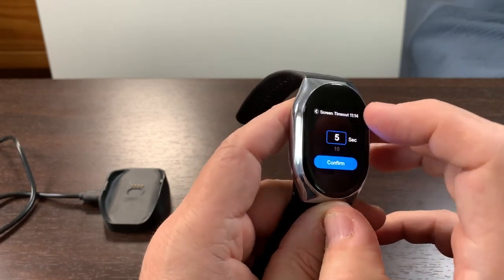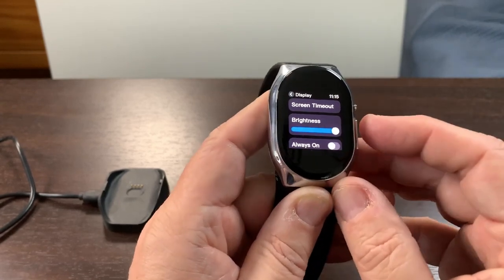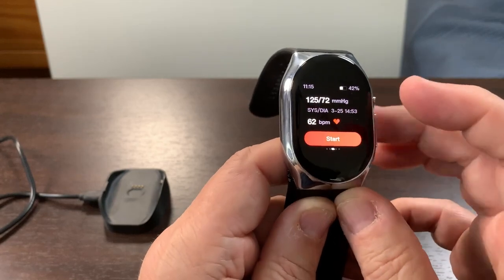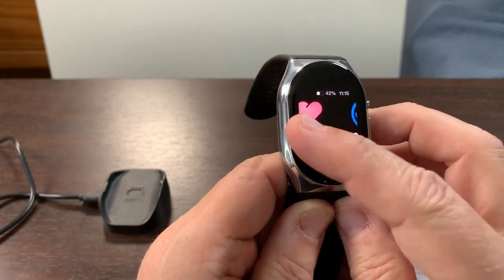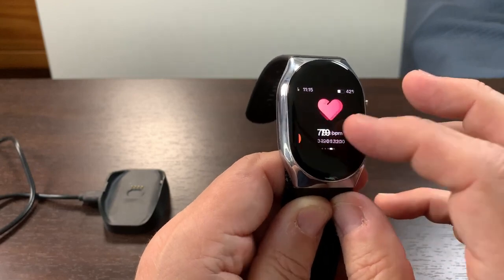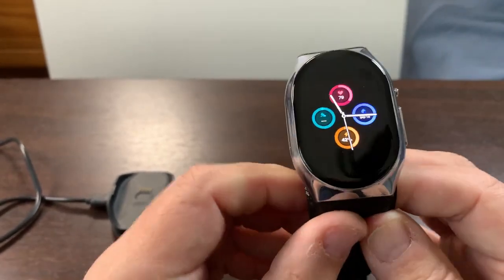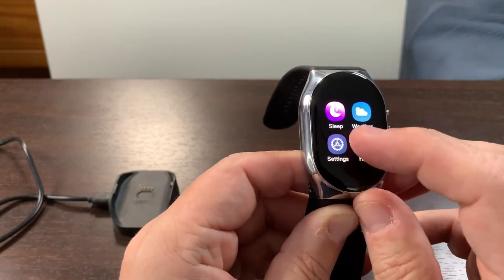I need to set the screen timeout — let's set it to at least 20 seconds so we can get a good look. You can change this display and move along to your heart rate, see what your pulse is, your blood oxygen level. For these health reasons, this is an excellent watch.